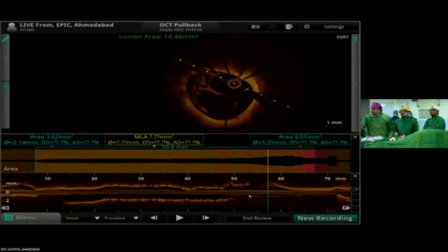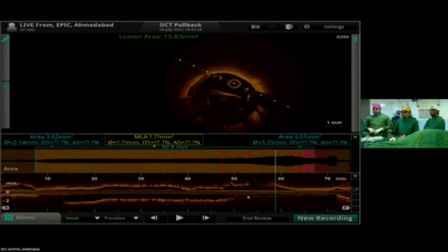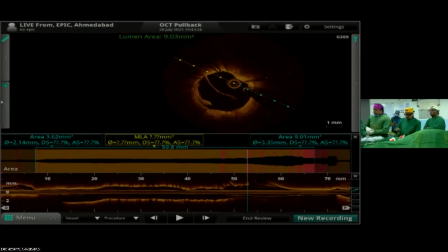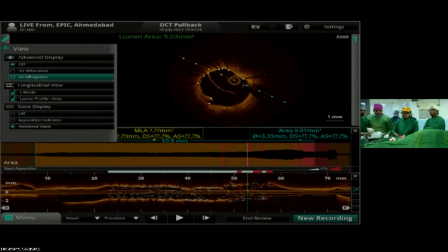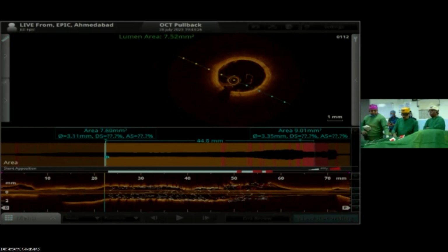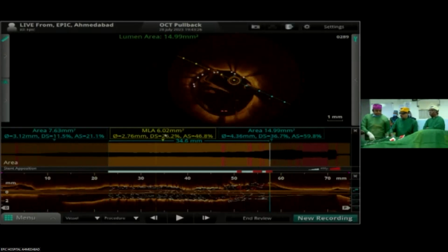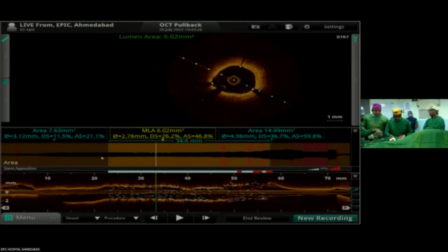I agree. For the audience, Ramesh, the question Rishi asked me, basically the answer is you have a size mismatch. That makes people think about whether to do ostial LAD stenting alone, that is a major point. I think otherwise. The mismatch is size mismatch, 6 millimeter to 4 millimeters, 3.5 millimeter.